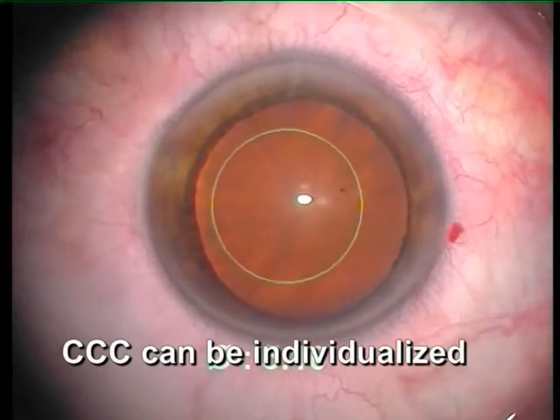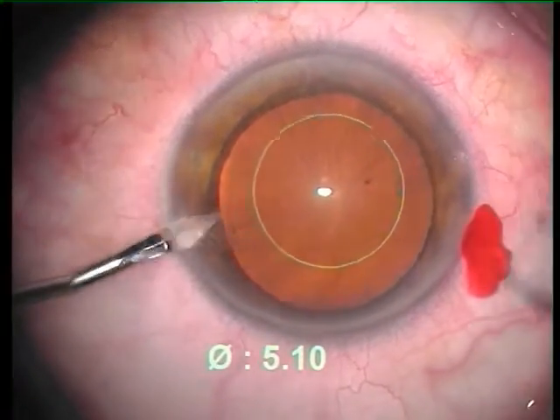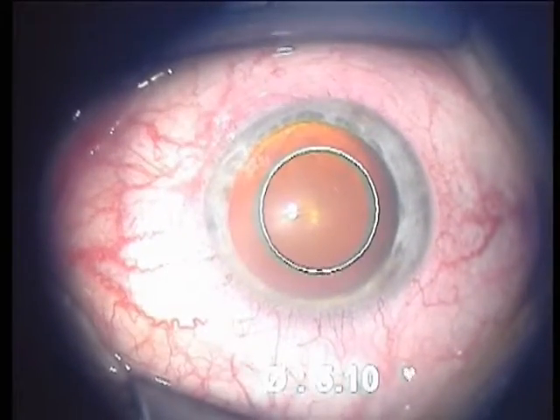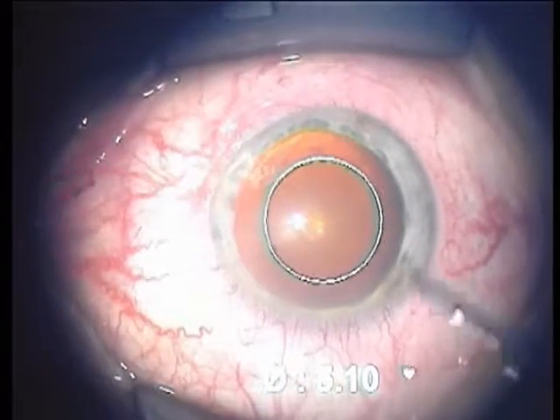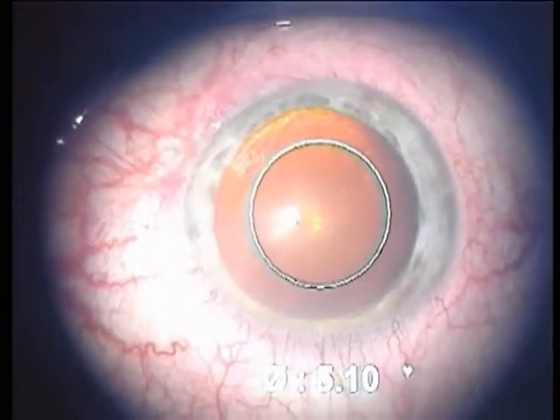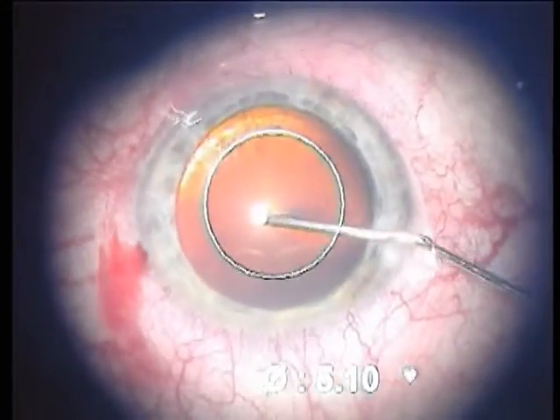In order to calculate the correct size of the circle in the displayed plane, the opto-geometrical data of the surgical microscope — like the focal lengths and selected magnification — the biometric data of the eye, as well as the desired target diameter, are used to compute the image ratio between the object plane and the injection module. The pupil centre is recorded by determining the centroid of the pupil.